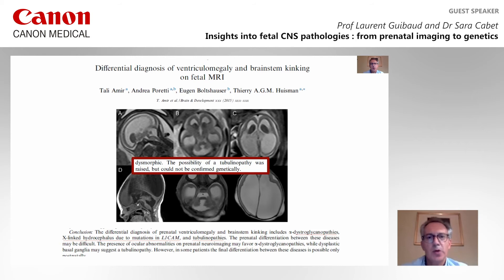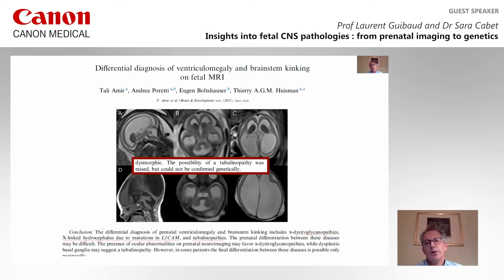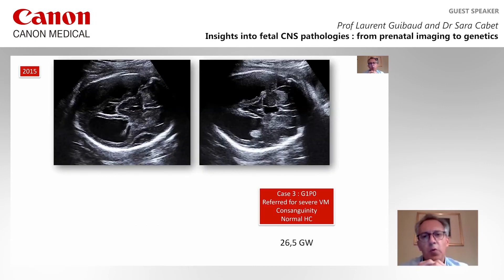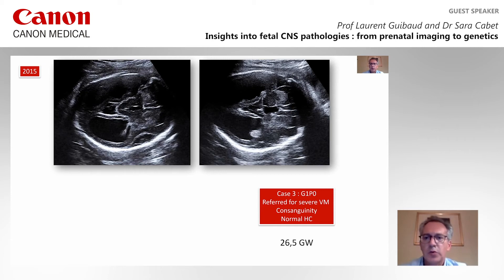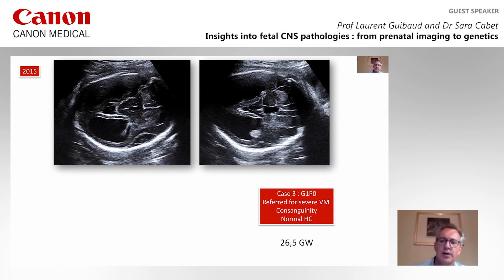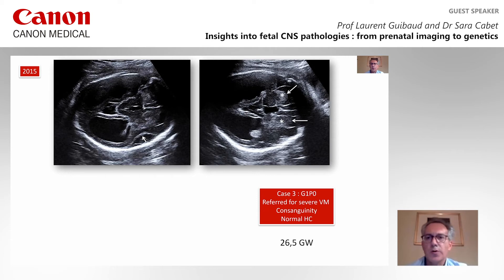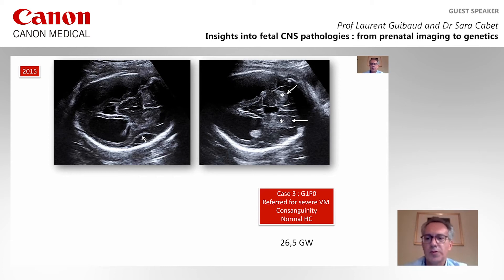This possibility was strong but was not confirmed genetically. We encountered a similar case in 2015, which is the third case of our lecture. These patients were referred for severe ventriculomegaly at 27 weeks of gestation in the context of consanguinity with normal cephalic biometry. The Sylvian fissure is widely open for a patient at 27 weeks of gestation, and there are huge protrusions in the ventricular system suggestive of very voluminous germinal matrix.